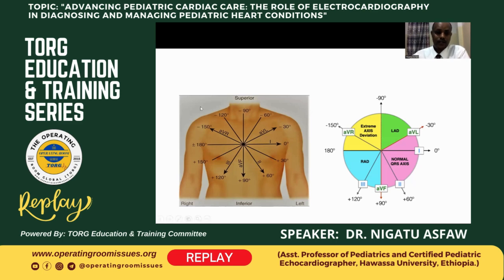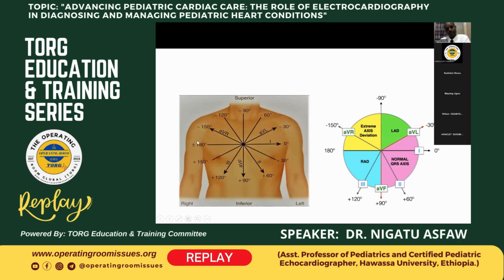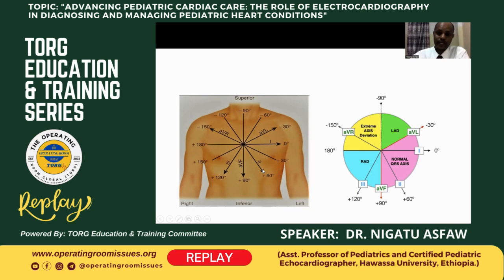Lead 1 will record electrical activity, making the right arm negative and the left arm positive, so it will be at 0 degrees. And lead 2 records electrical activity, making the right arm the reference and the left leg as the positive electrode, so the vector direction is 60 degrees.